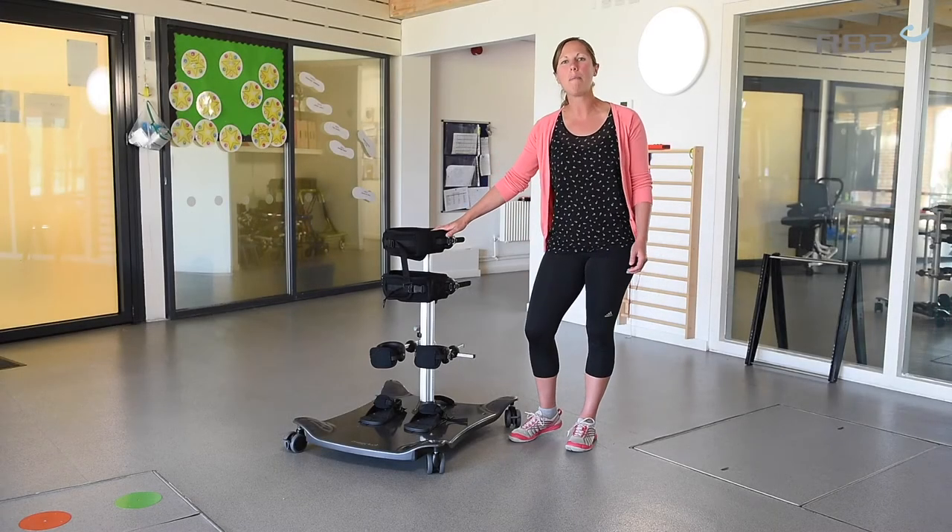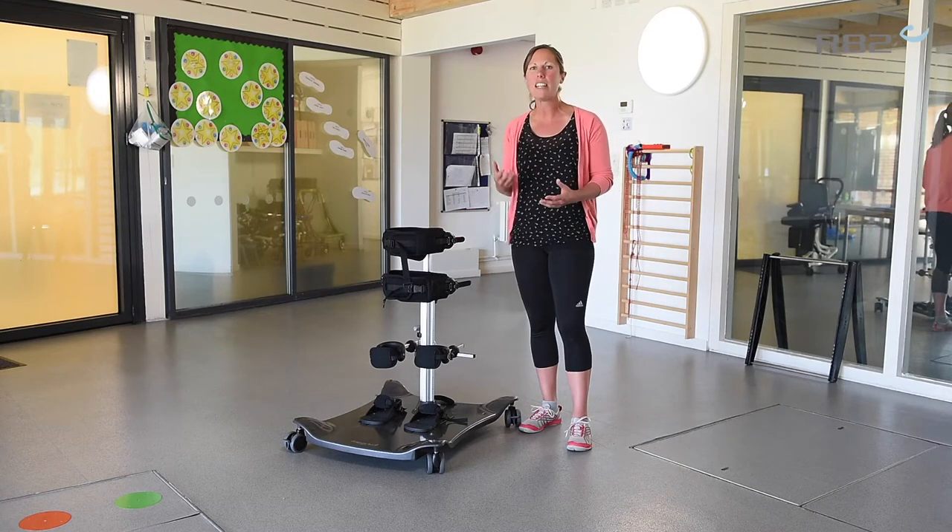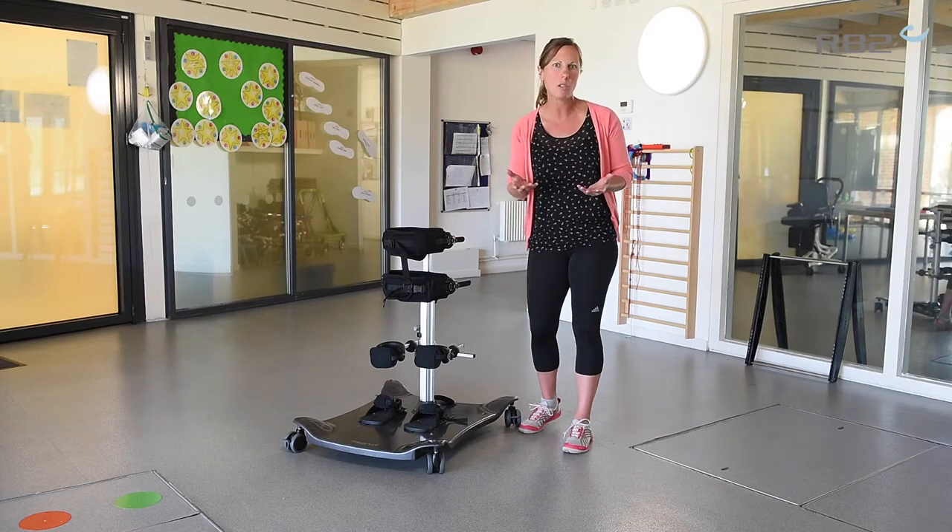Hi, I'm Frances and I'm here to talk to you about the adjustable set up of the meerkat. The meerkat can be used in both anterior and posterior settings. So why might we select each one?